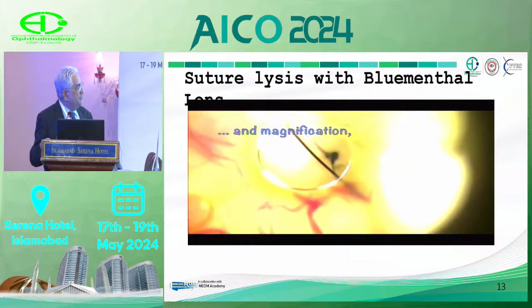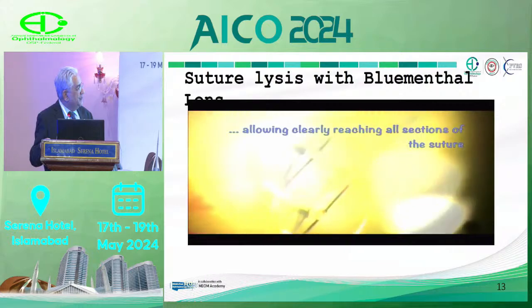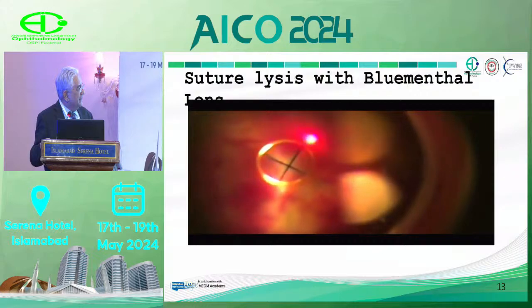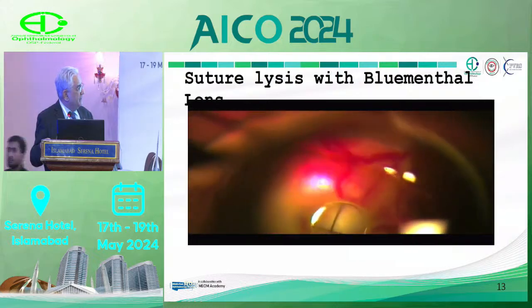This lens gives you magnification as well. And you can see the suture very easily. And there you can hit the center, and all four pieces will go apart.